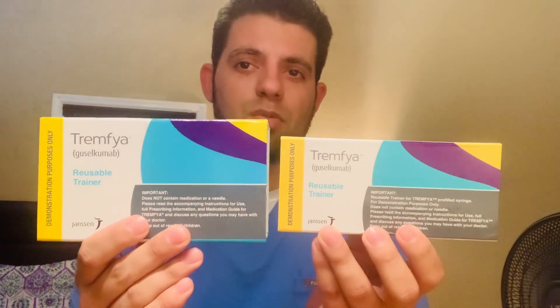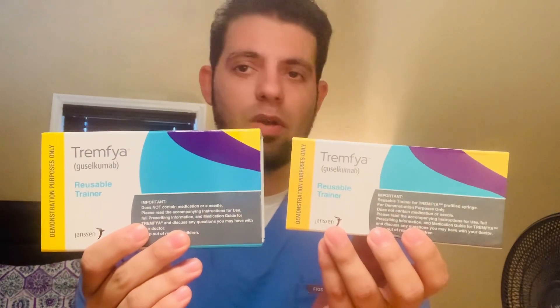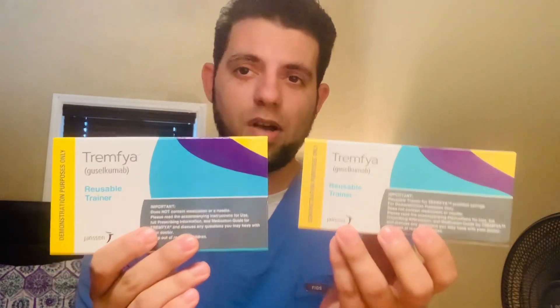This one is called Tremphaya. Tremphaya has been proven to be one of the best medications that we have for patients that suffer from psoriasis. Something that I like about this medication is the fact that you can get it in two different methods — either the pre-filled syringe or the pre-filled pen injector. Either one is a really good option. Let me show you how both work.